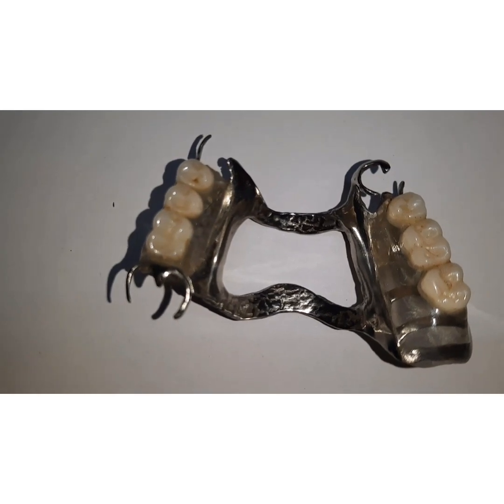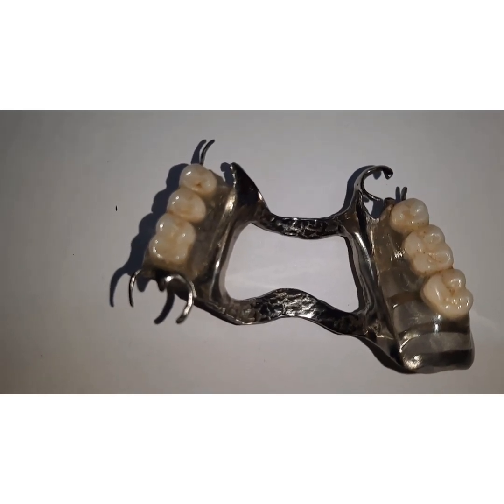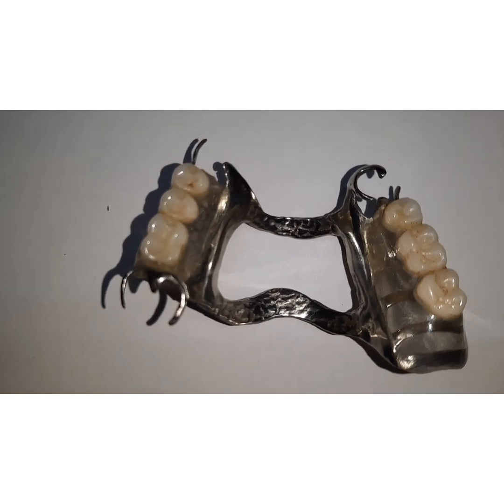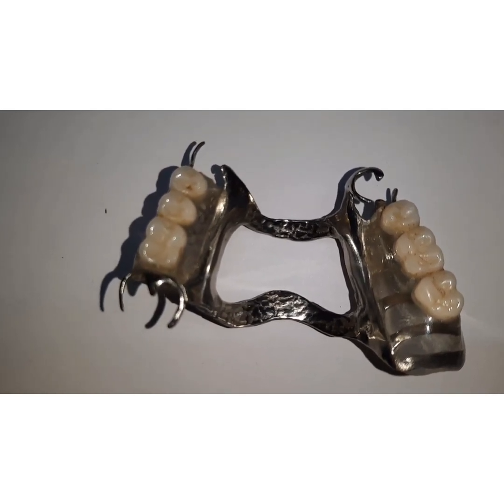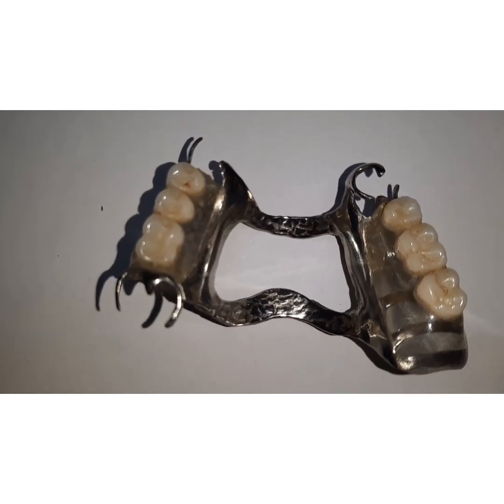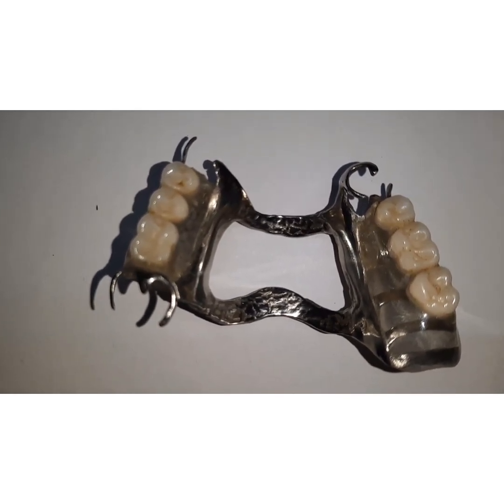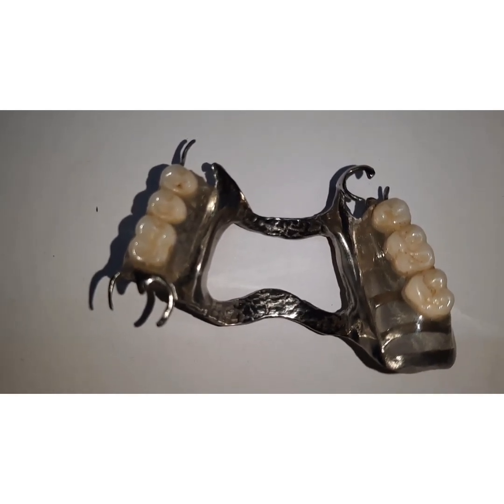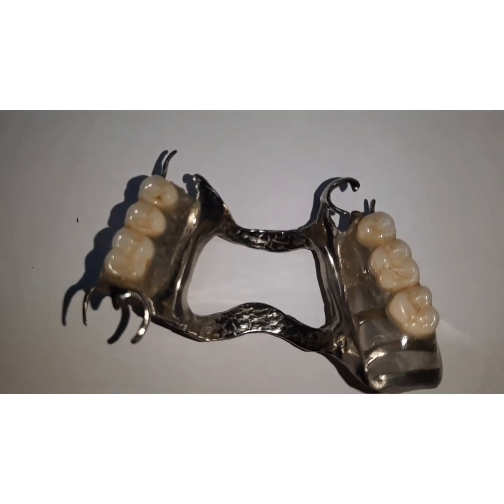Another way in which we can do this is by laboratory remounting procedures, where the completed partial denture is remounted on the articulator, and any occlusal discrepancy is identified and corrected on the articulator itself. So this will help in saving chairside time.